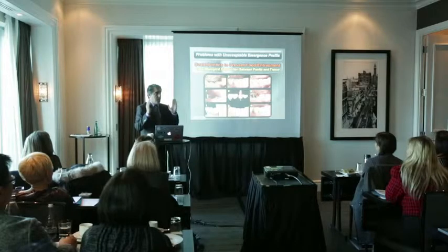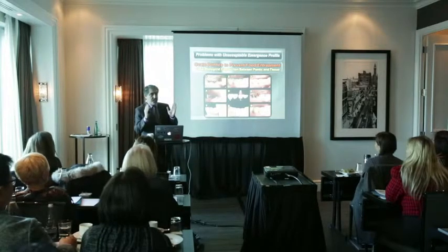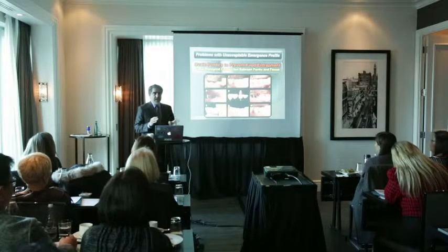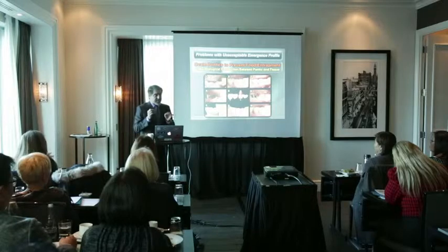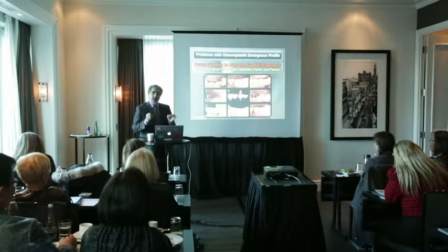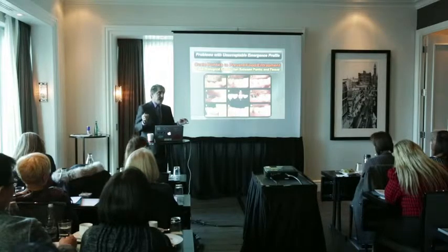So it's better to recontour the mesial, distal, adjacent teeth. That's number one. I always do that. Do this also in your RPD cases. That's extremely important too. When you have an RPD case, don't be afraid of recontouring the abutment teeth. It's exactly the same concept here.